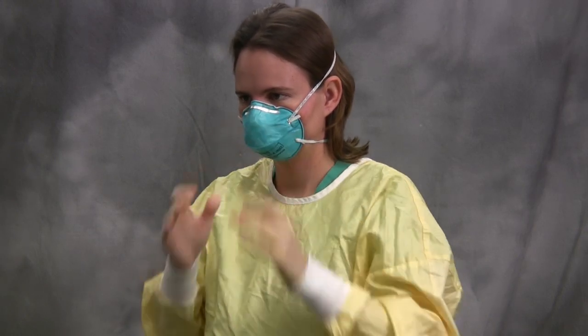The elastic straps should be in contact with the skin on your neck, so remove any hair that is in the way. Press the mask along the edges to seal it to your skin. Finally, breathe deeply in and out, feeling for any areas where air may be escaping along the edges.